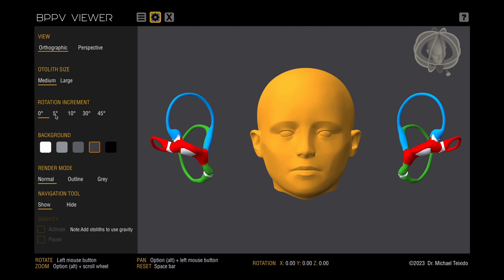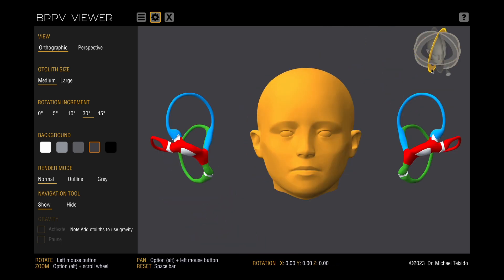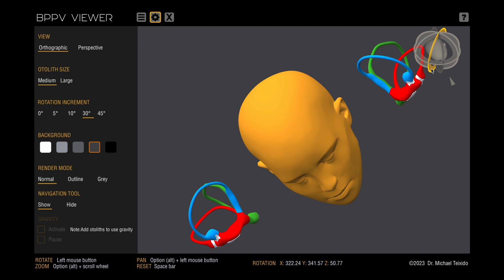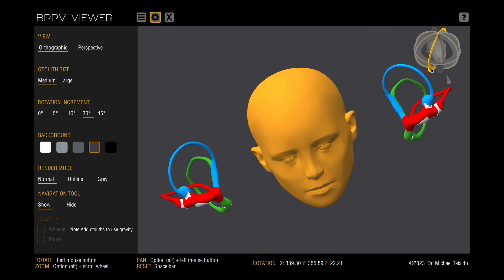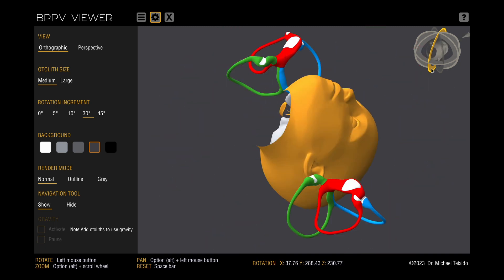On the top right side, you'll find the Navigation tool, which allows you to rotate the head at specific angular increments around the X, Y, or Z axes, as well as around the RALP and LARP planes. To use this tool, hover your mouse over the plane of interest and scroll. This tool is particularly useful for locating head positions commonly used in diagnosing and treating BPPV.